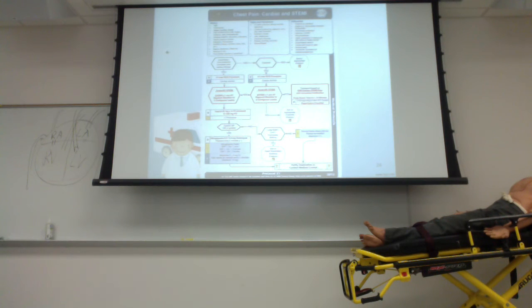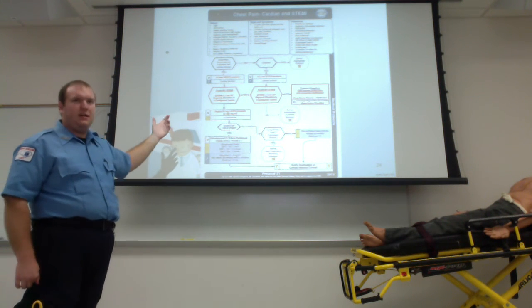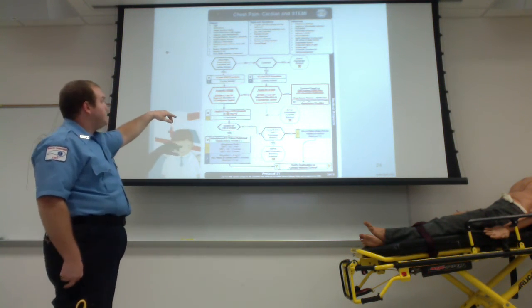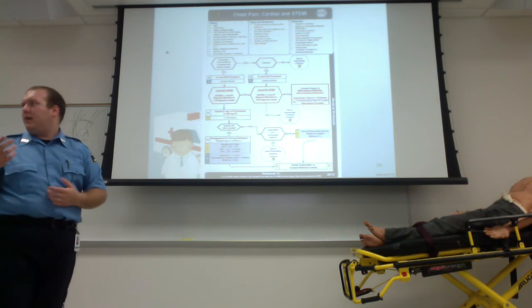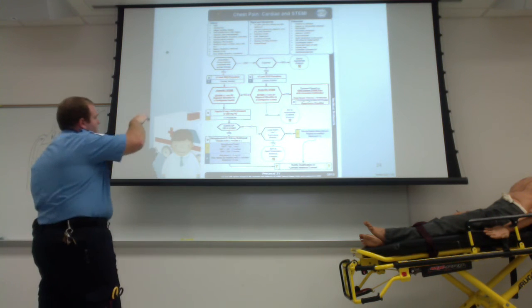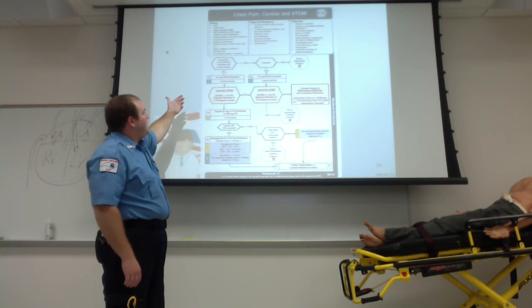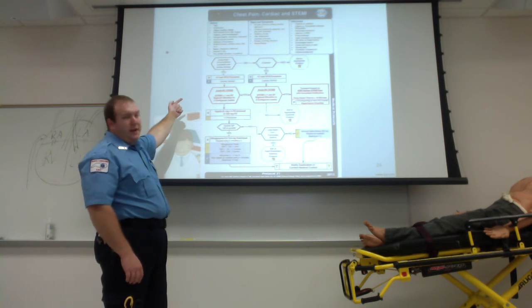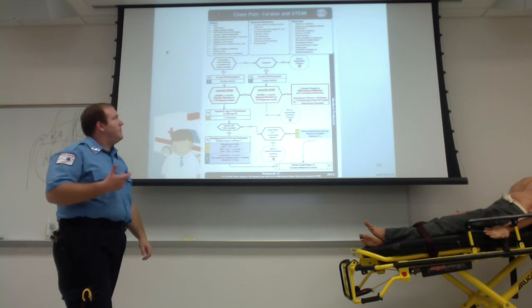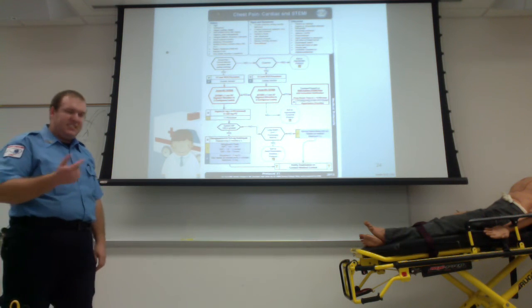I should come down here, I mentioned earlier, we'll talk about the protocols here. This is your North Carolina protocol. This is just the generic North Carolina chest pain protocol, talking about who can place that 12 lead. If you look over here, starting off with chest pain, yes, they have chest pain. But guess what? A basic, they're in the white box, can start a 12 lead. 12 lead EKG, ECG, EKG, same thing.